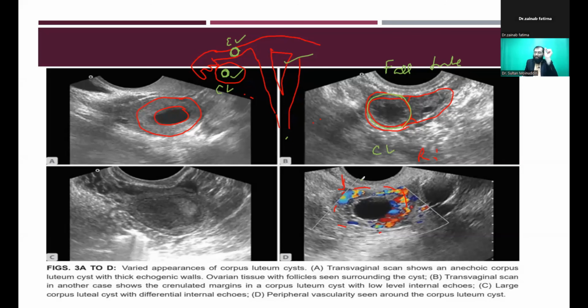Ovarian ectopic is diagnosed when you see a fetal pole within this. If you are able to see a fetal pole or yolk sac within this corpus luteum looking structure, then you would be able to say that this is an ovarian ectopic. And of course, one of the important signs which Rashmi has highlighted, there will be two rings of fire.